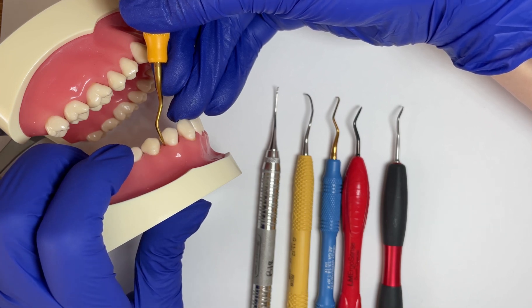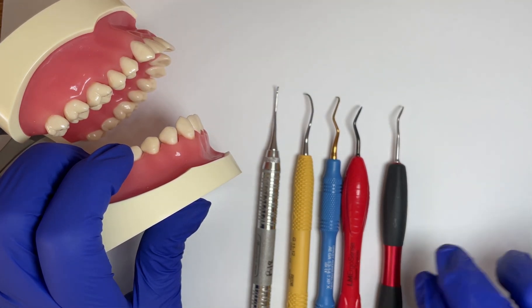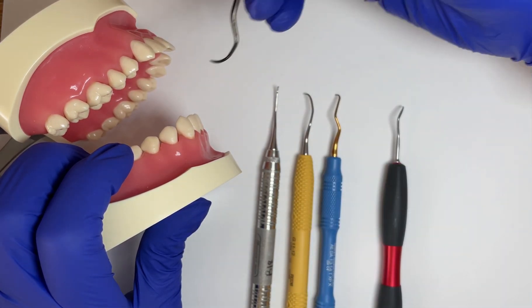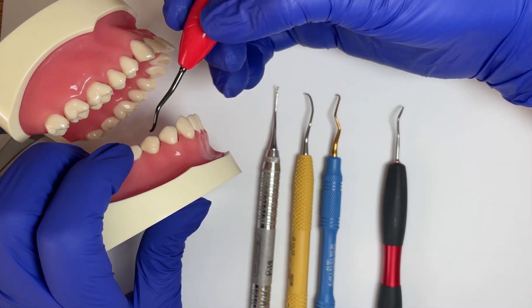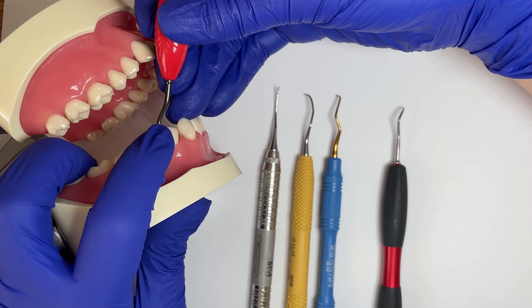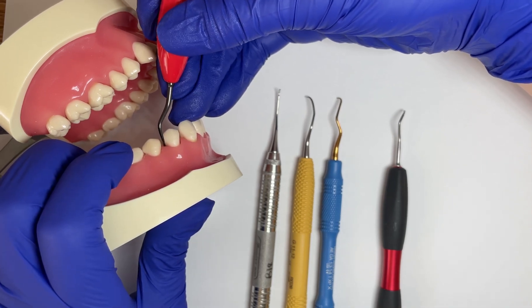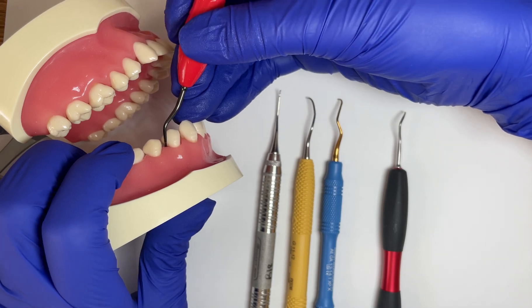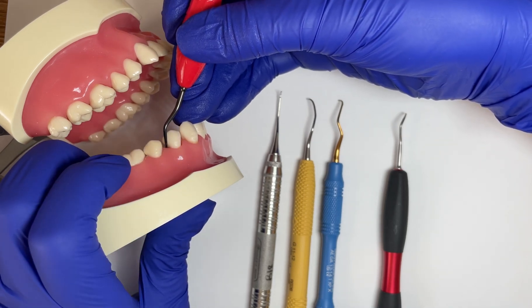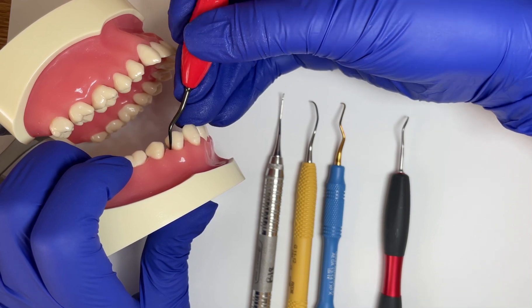Another factor that makes the lower terminal shank really important: once I find my correct working end — determined by the terminal shank being parallel to the long axis of the tooth — when I want to activate on this tooth, I go to a 70 to 80 degree angle based on that terminal shank, and then I can do my strokes at that 70 to 80 degree angle.